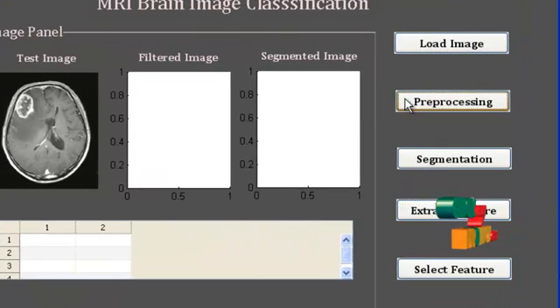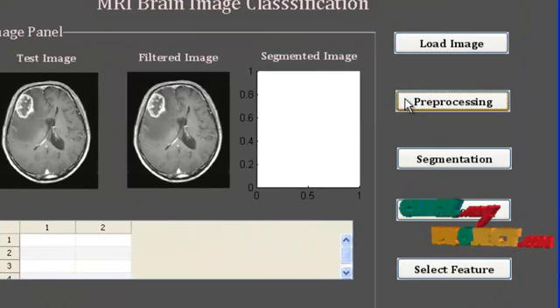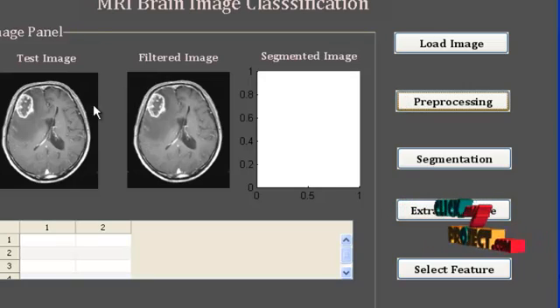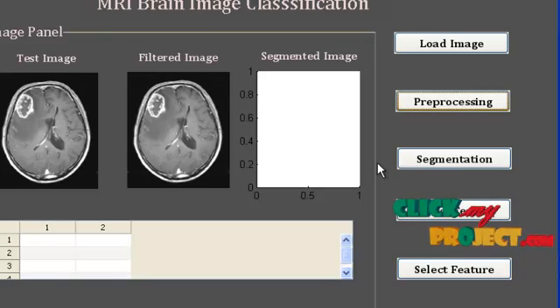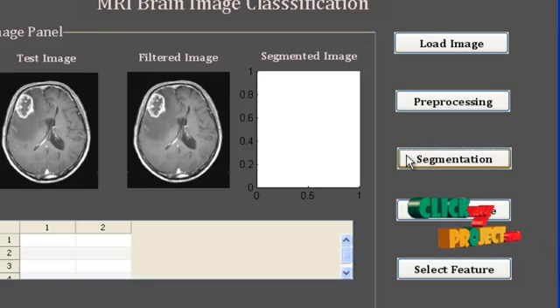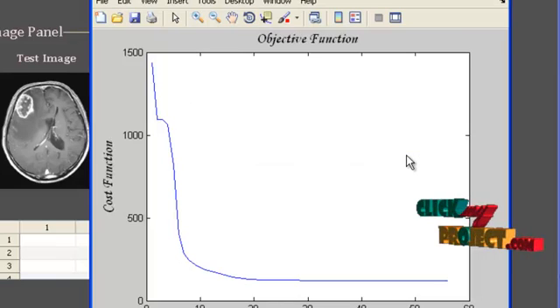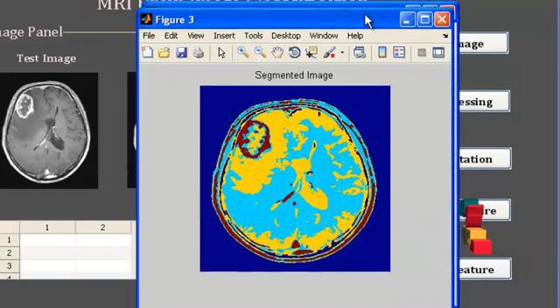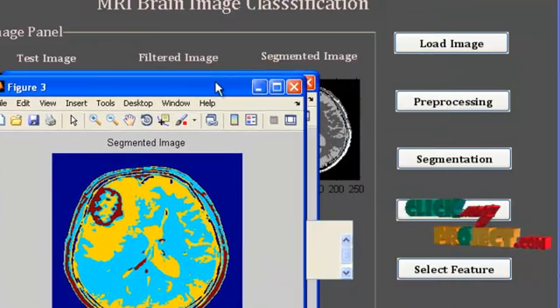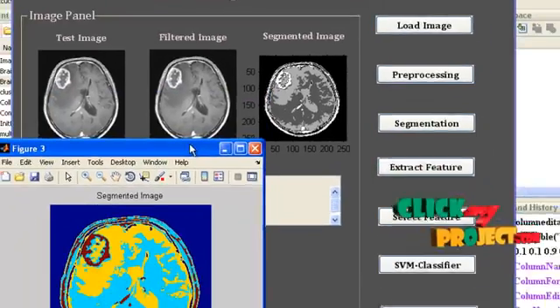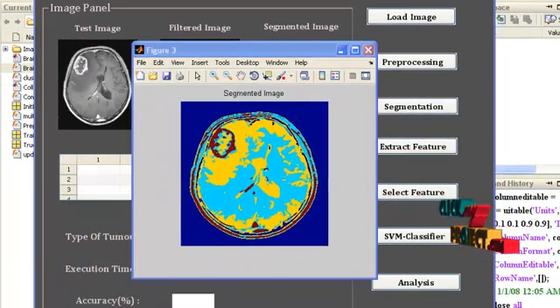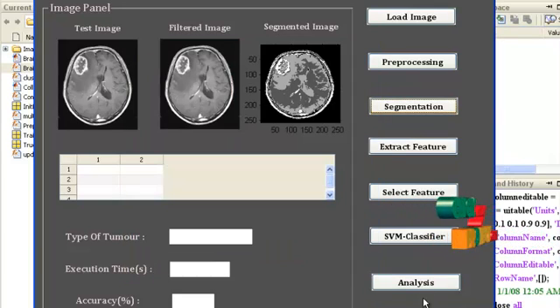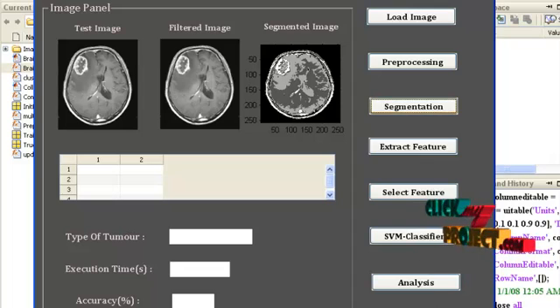Next, do the pre-processing. Pre-processing is the median filtering algorithm applied on the given test image, and it is also displayed next to the test image. Next, press segmentation. Segmentation uses the modified Fuzzy C-Means clustering algorithm. The segmented image is now shown in color format as well as in grayscale. Meanwhile, the objective function graph is also displayed, which is generated during the Fuzzy C-Means clustering algorithm.